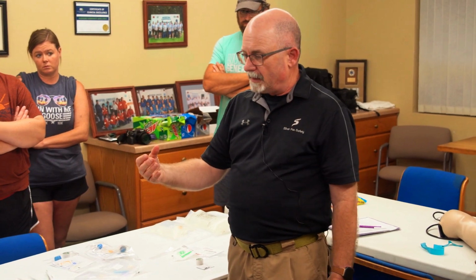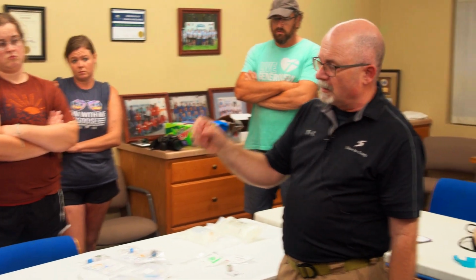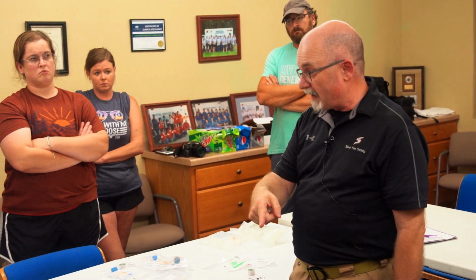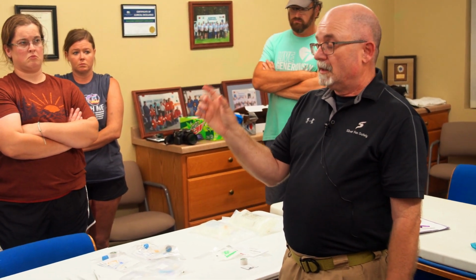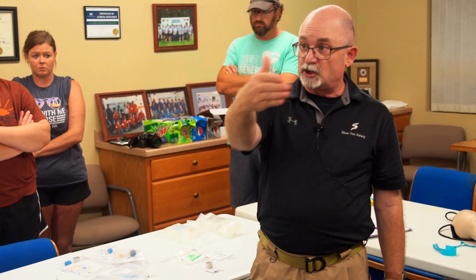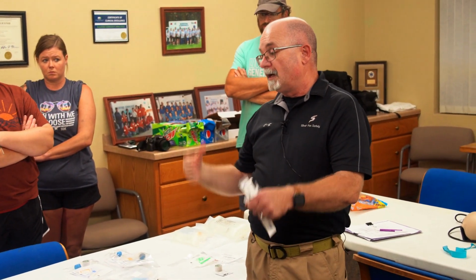What are you using for charting? Are you using the States Elite? Okay. So in there, you'll have a procedure, IV, so initiating an IV, and then a medication, normal saline. The normal saline is the dose, and usually I enter that as total dose in. If you were to give it as boluses, that's up to you guys how you want to do it. I would clarify that probably in the narrative. I'd want to be able to deliver the total dose by the end of that report, because when I finish my chart out, that should total.